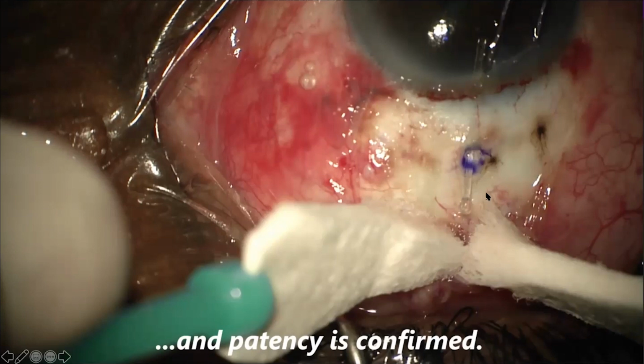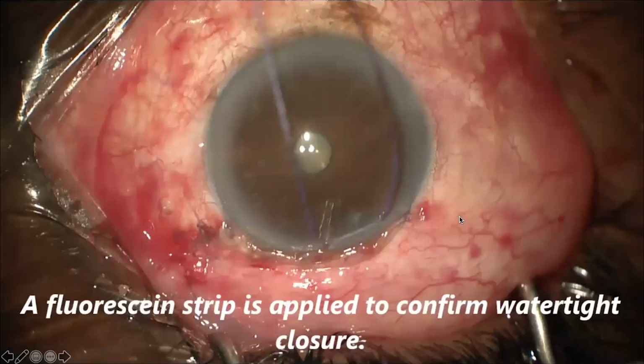It's all about Poiseuille's law. Based upon the length and luminal diameter, we should have this nice trickle of flow that you get from the anterior chamber outside the eye. So we're confirming patency. And then a watertight closure. That's it. It's as simple as that.